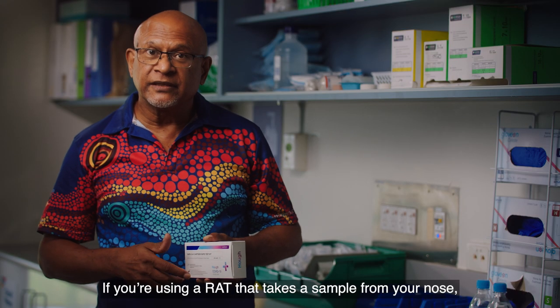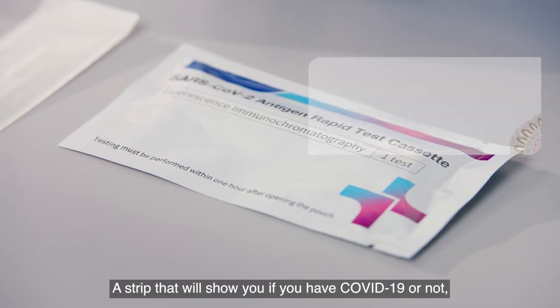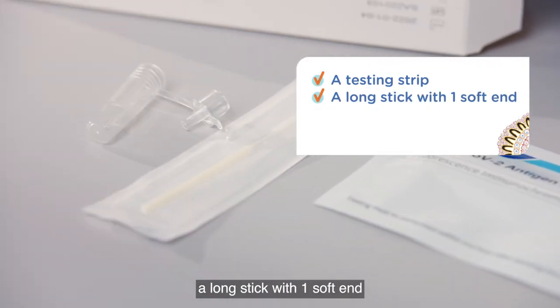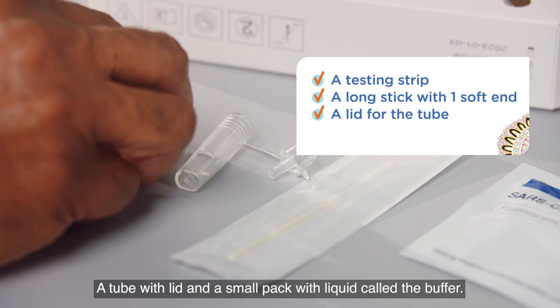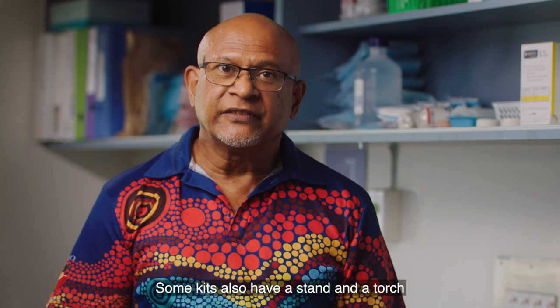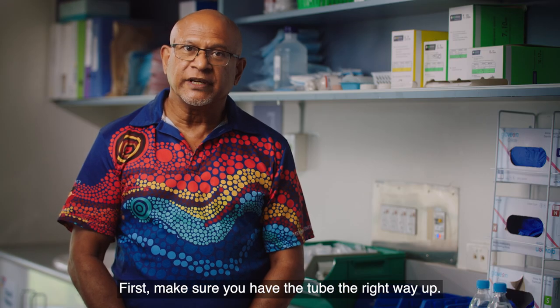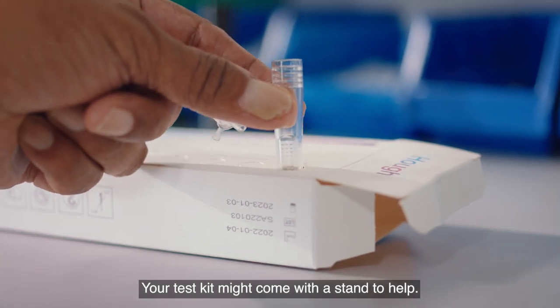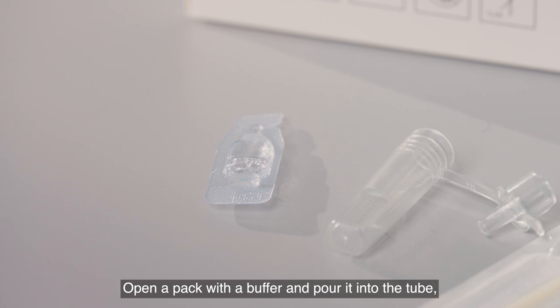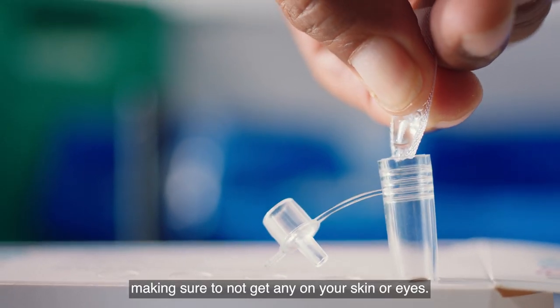If you're using a RAT that takes a sample from your nose, inside your toolkit you'll find a strip that will show you if you have COVID-19 or not, a long stick with one soft end, a tube with a lid, and a small pack with liquid called the buffer. Some kits also have a stand and a torch. First, make sure you have the tube the right way up — your test kit might come with a stand to help. Be careful not to let the tube fall over. Open the pack with the buffer and pour it into the tube, making sure not to get any on your skin or eyes.